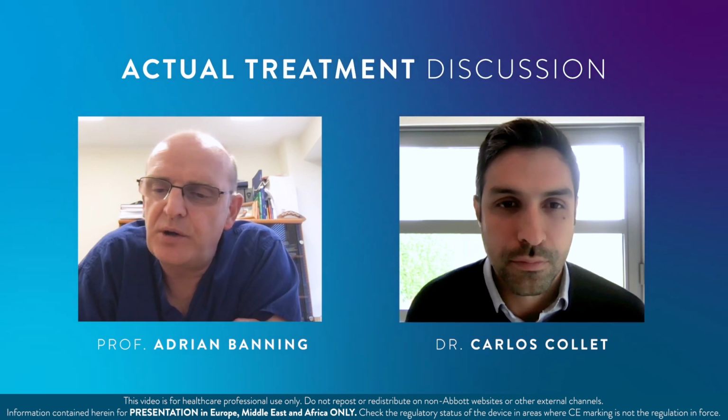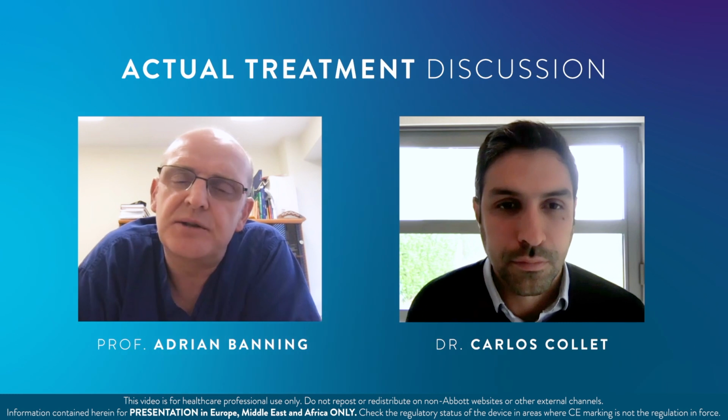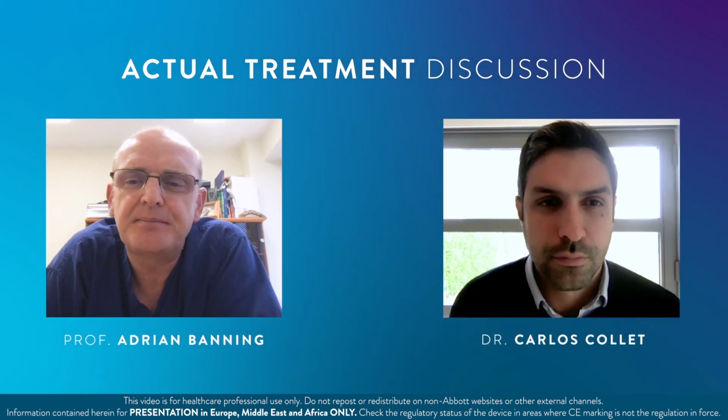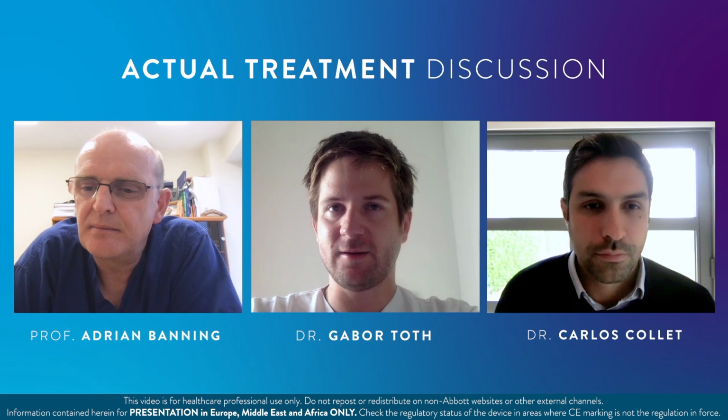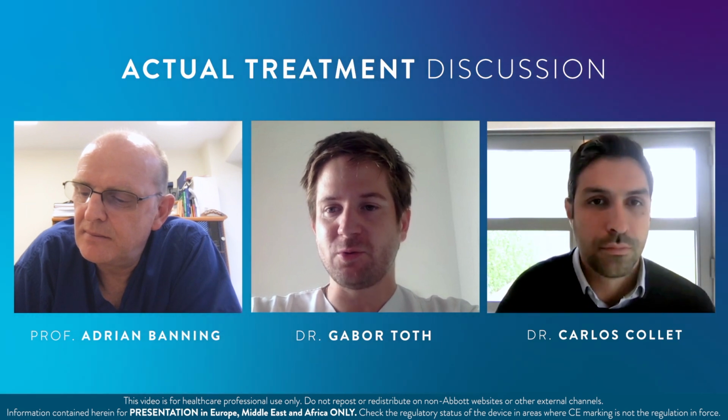So Gabor, what were your thoughts about the way that Carlos has managed to treat this bifurcation? It's a different story as compared to when you see a native de novo stenosis and you have to select the technique. This patient already has a layer of stents in the side branch, a layer of stents in the main branch, and now you just go to optimize, or at least correct the results of that.